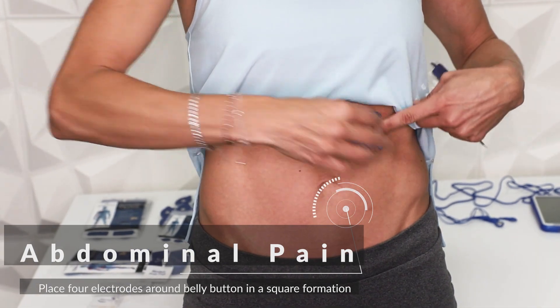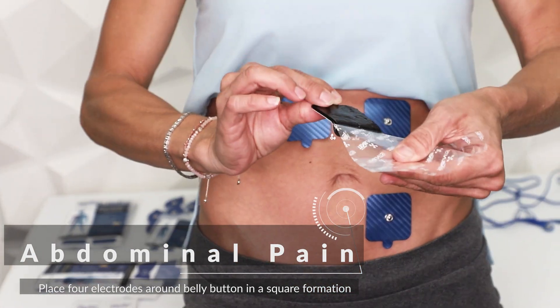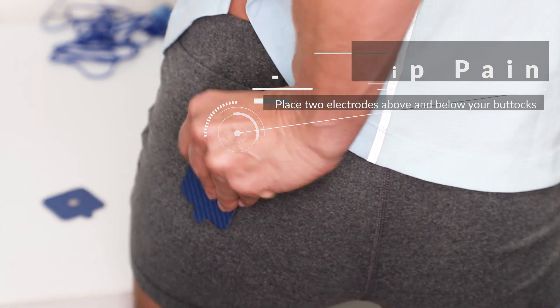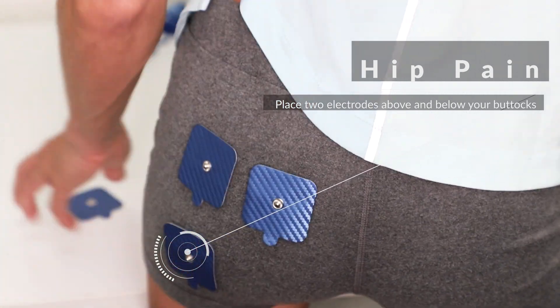If you are experiencing abdominal pain, place four electrodes around your belly button in a square formation. For hip pain, place two electrodes on the upper part of your buttocks and two below your buttocks.